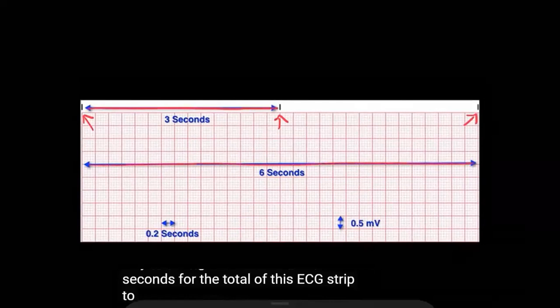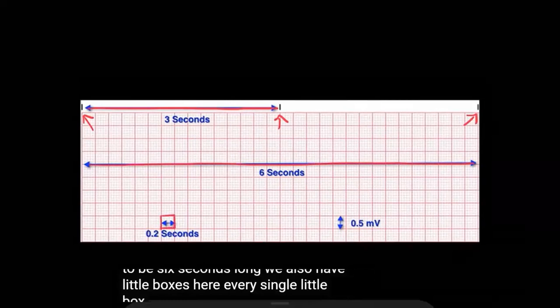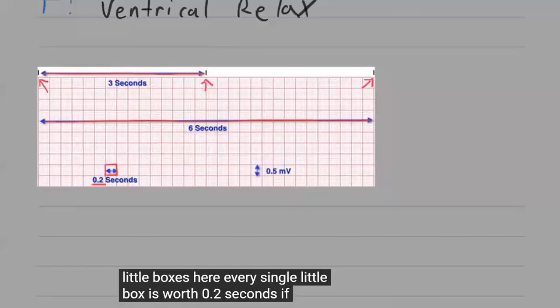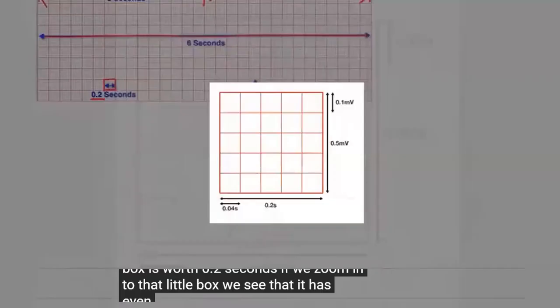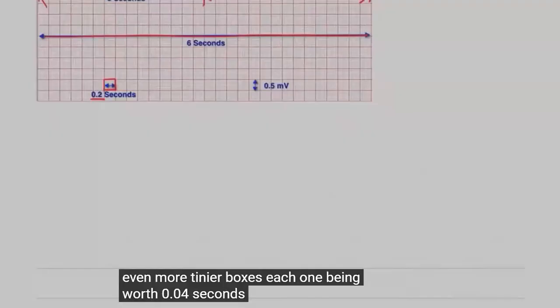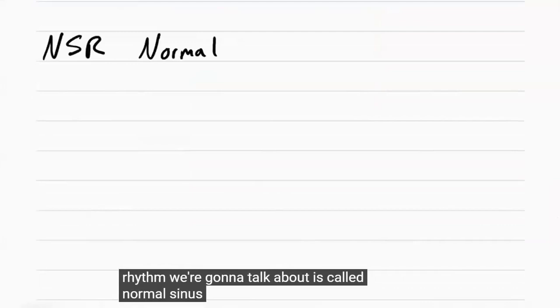We also have little boxes here. Every single little box is worth 0.2 seconds. If we zoom in to that little box, we see that it has even more tinier boxes, each one being worth 0.04 seconds. All right, so the first rhythm we're going to talk about is called normal sinus rhythm.